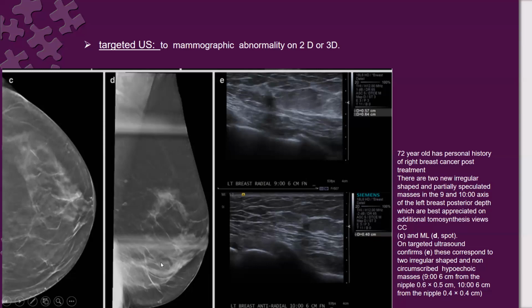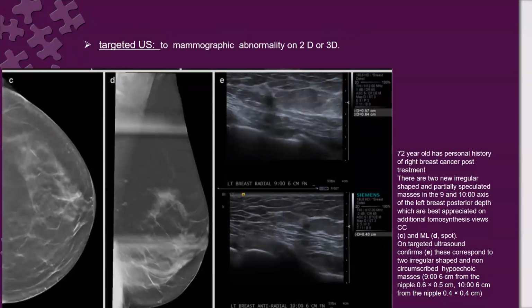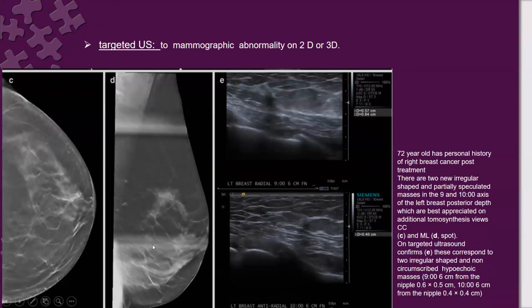The spot compression views. Yes. Spot lagging, it is the same as that one. It is just spot. Look for this mammography and look for this mammography. Is it the same? The second one looks like tomosynthesis. Excellent. Who's talking? Me, Suhair. Suhair, you're welcome. Yes, this is a tomosynthesis spot view here.